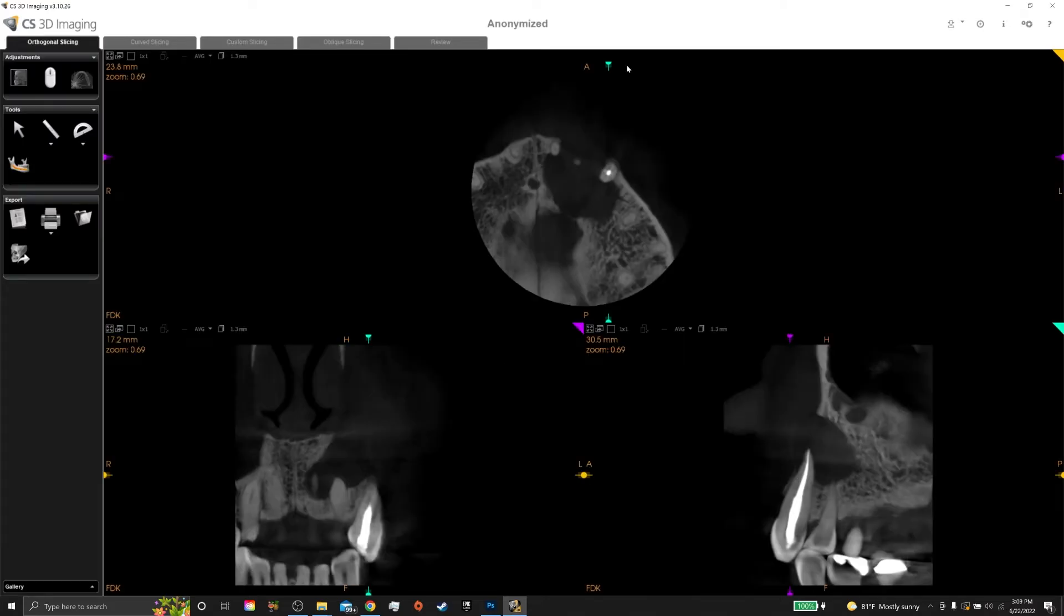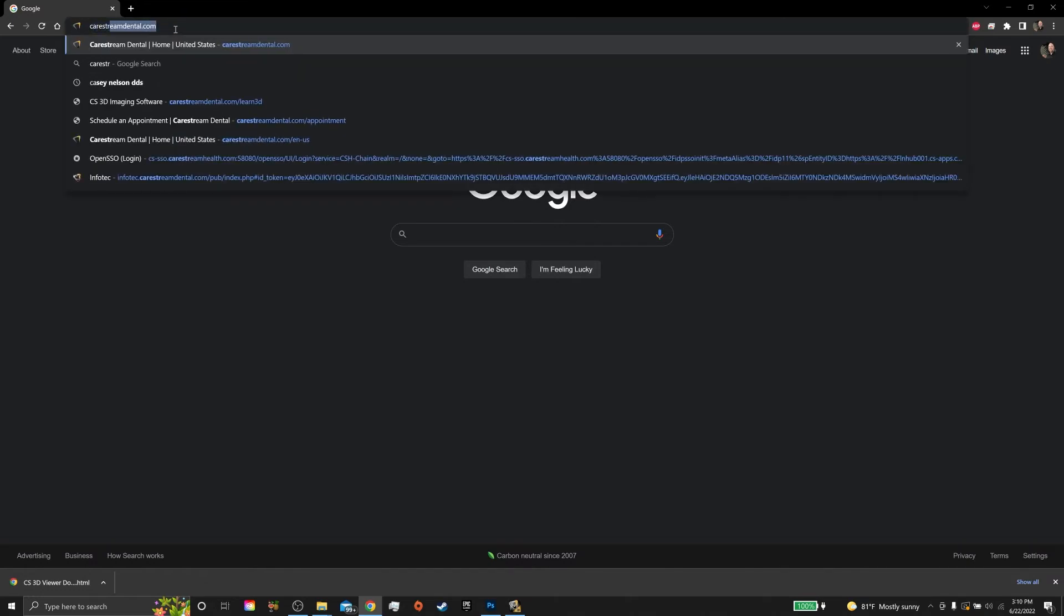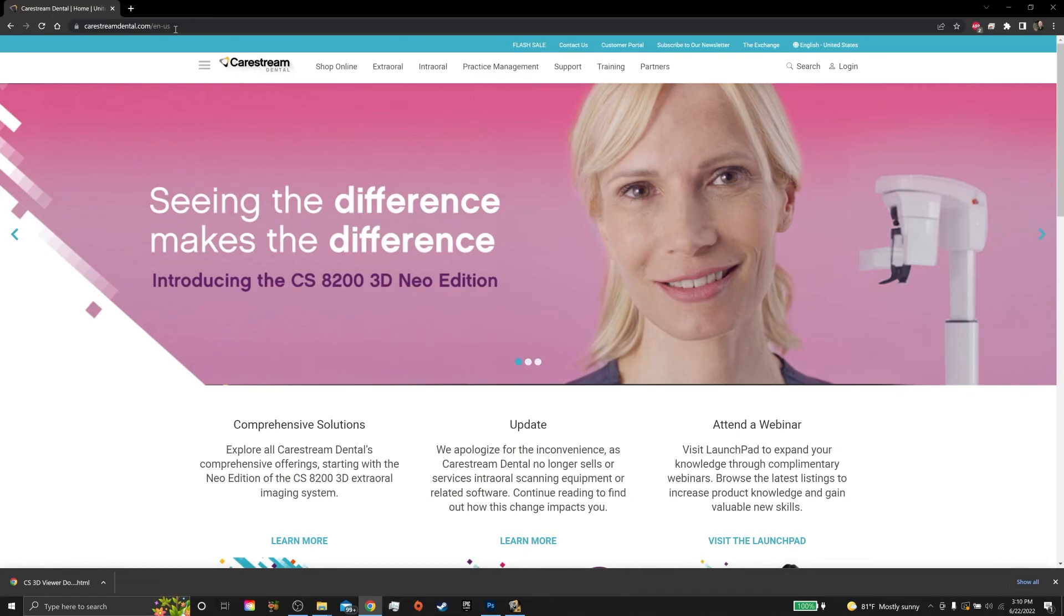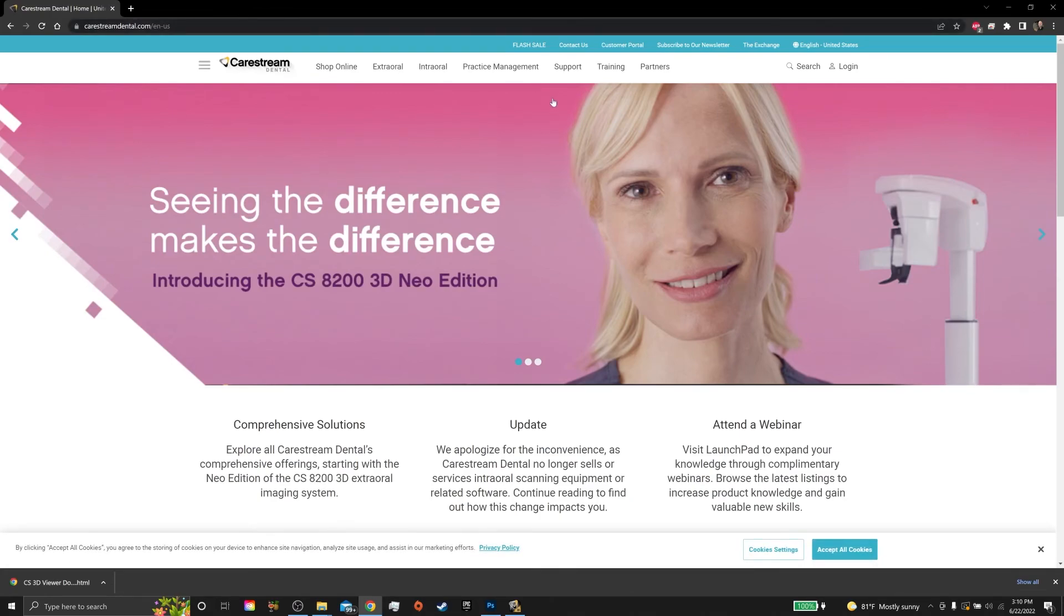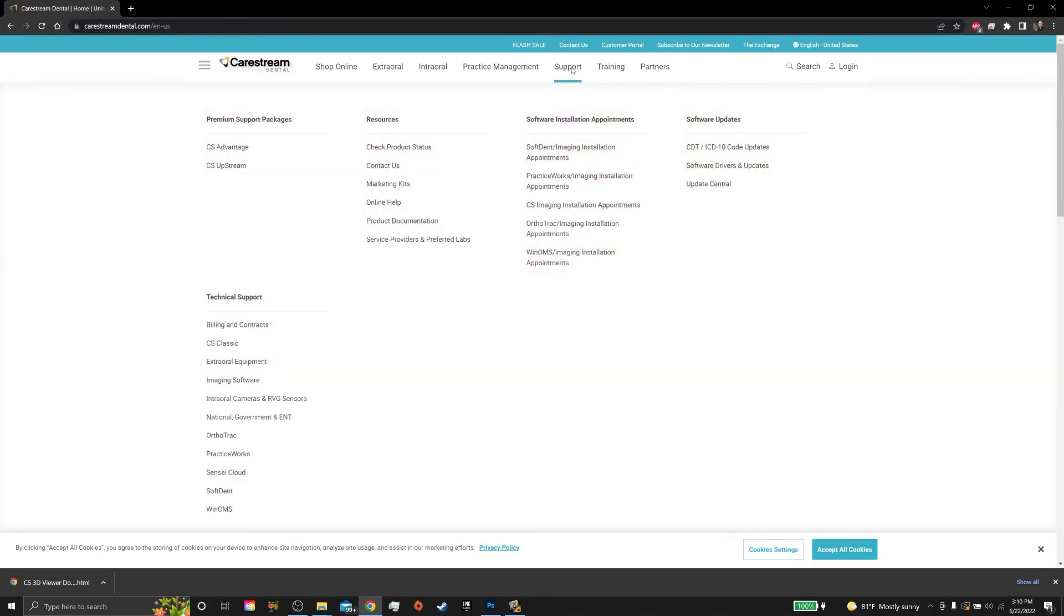The other way to view the radiographs is to download a full version of the 3D viewing software. We do that by opening up a web browser and going to carestreamdental.com. Once you're on the CareStream Dental website, go to Support, and then down to Update Central.